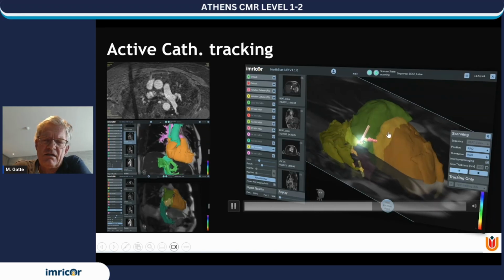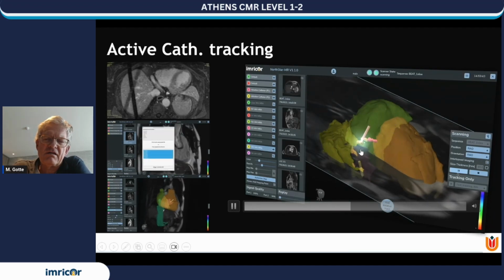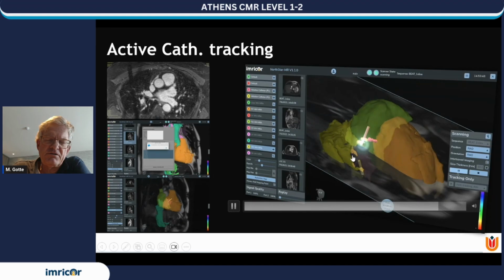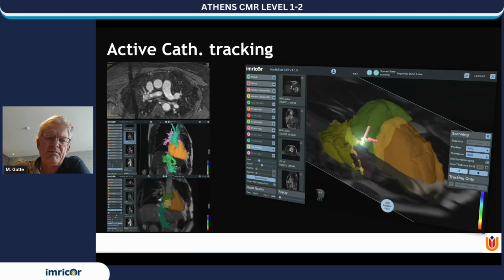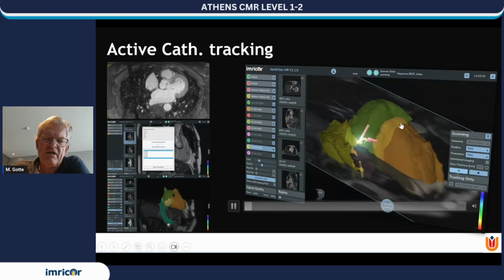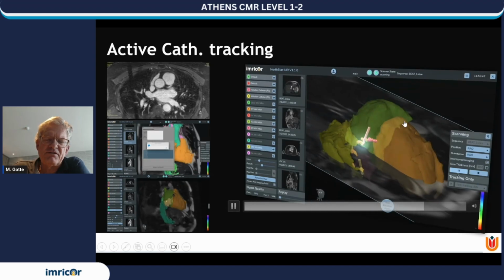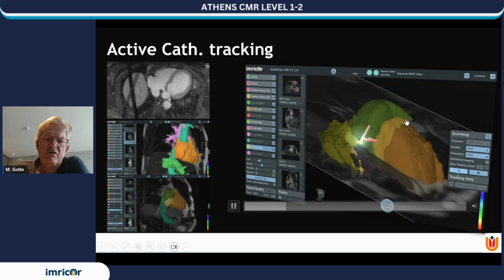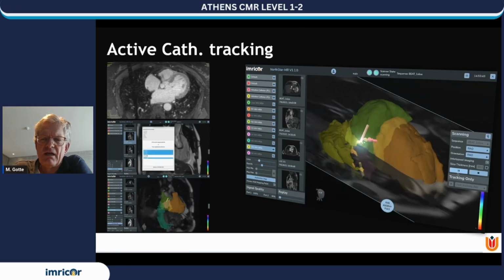It's still the responsibility of the imaging team, but on the other hand, it closes the bridge between the conventional mapping and navigation systems based at the cath lab with the MR environment, gives more comfort to the interventionalist, and it also offers new avenues for MRI-guided interventions.